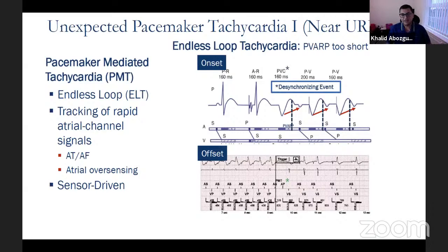Regarding the difficult scenario where Mohamed suggested that the patient is just recently revascularized, with poor RV or LV function, and the patient needs pacing support, it's a very, very difficult scenario. And I don't think anyone knows what the answer is. In our center, we tend to discuss these cases in what we call an MDT.